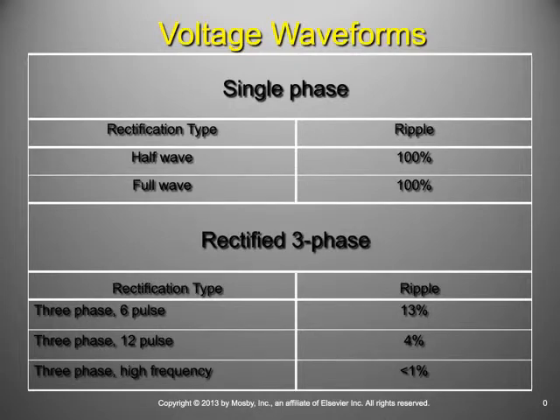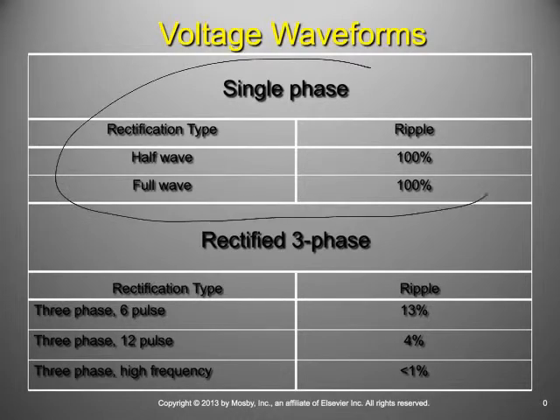So if we have a single phase X-ray tube, just recognize that any single phase, which I was just talking to Tom Wolfe about, he thinks that old machine that we've got is actually a single phase X-ray tube, means it has a 100% ripple. What does that mean? I don't really have room on this slide, so I'll write it on the whiteboard.